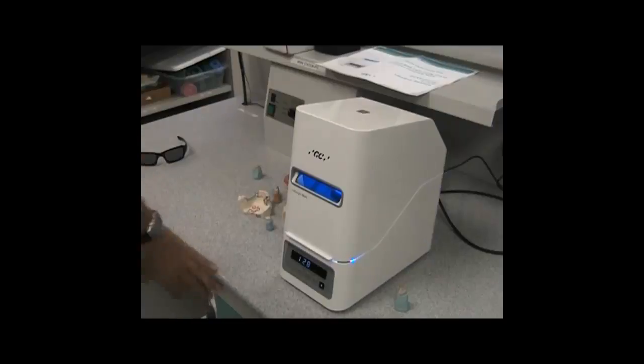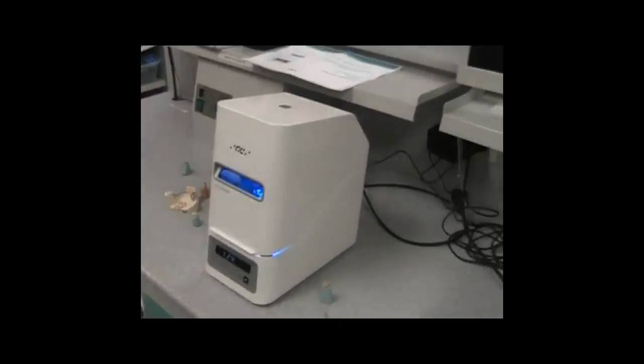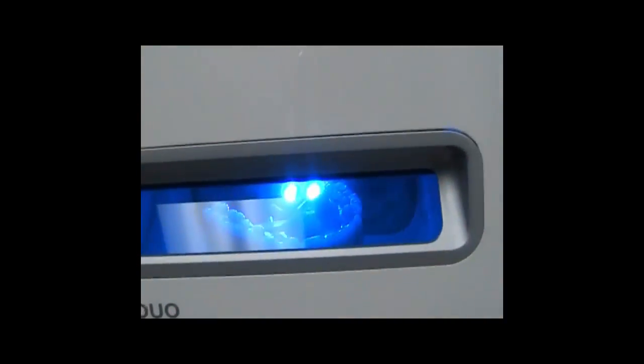I don't know if you can see this, but I'm going to take this little rascal like this, pull it off of here, and take it right down in there so you can see through the window. You can see that that's turning, elevated on a platform, and being hit from 3 different angles: oblique, horizontal, and vertical.